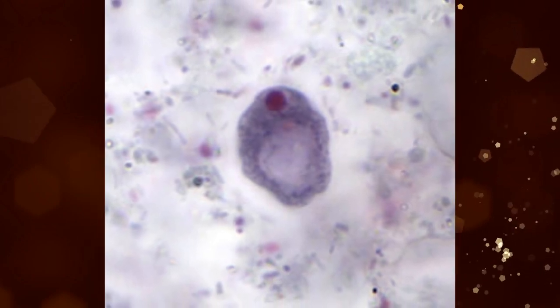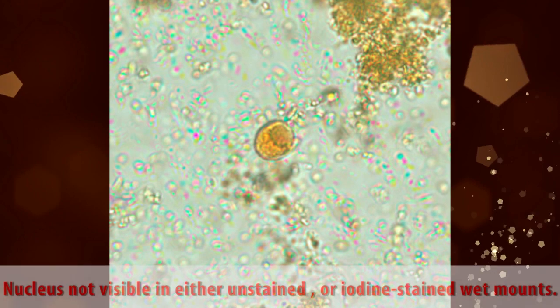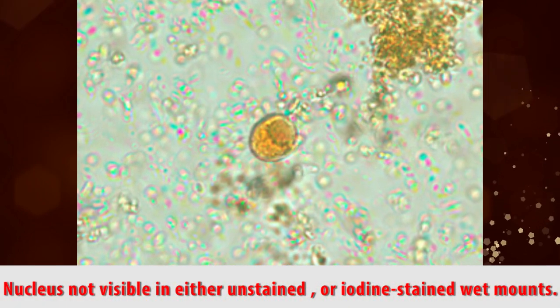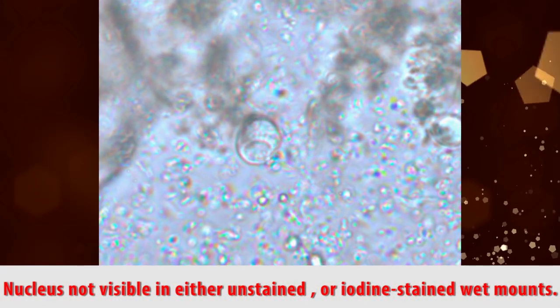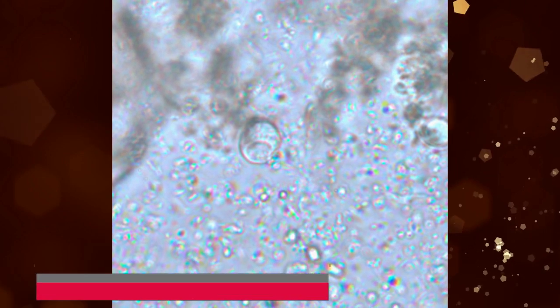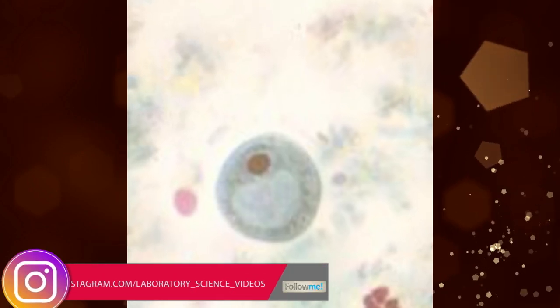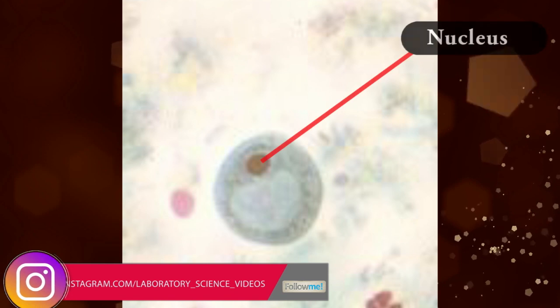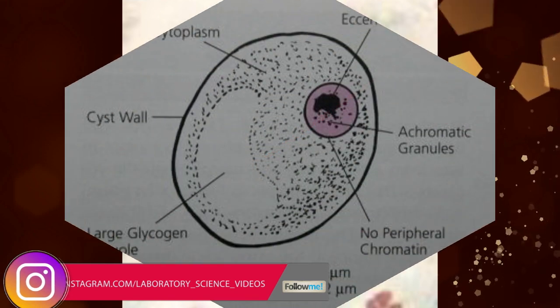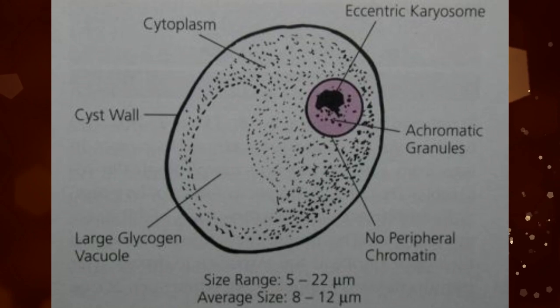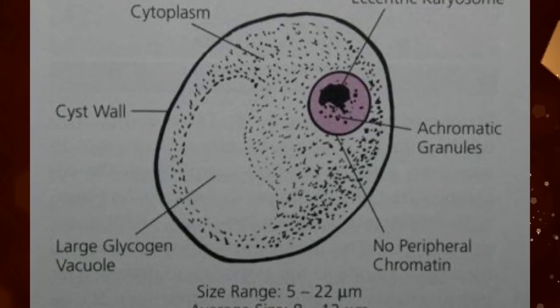Cysts contain almost always a single nucleus that is not visible in either unstained or iodine-stained wet mounts. With permanent stains such as trichrome, the nucleus is visible and contains a large, usually eccentric karyosome. Achromatic granules may or may not be present around the karyosome.